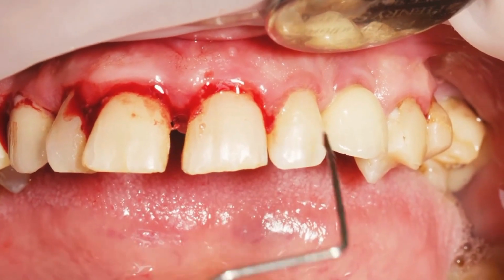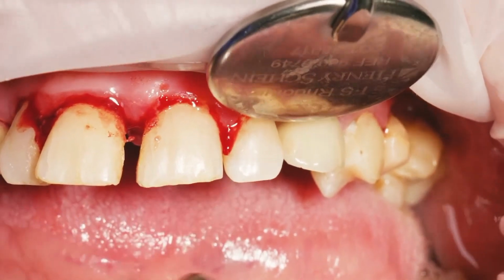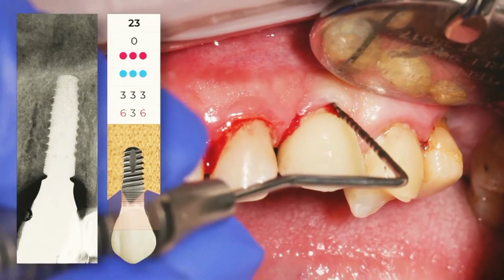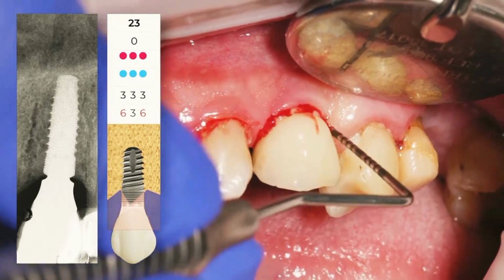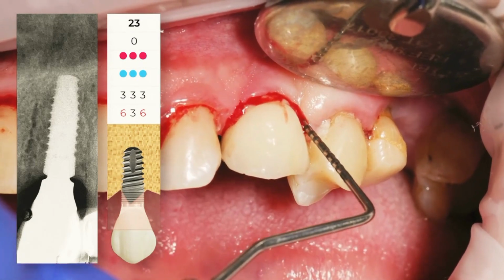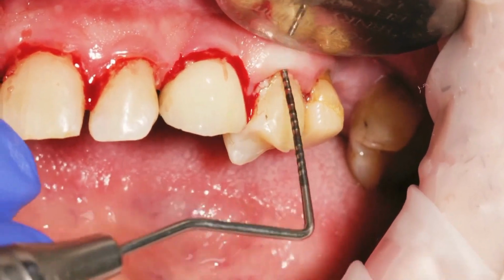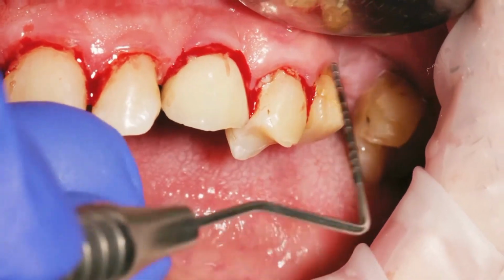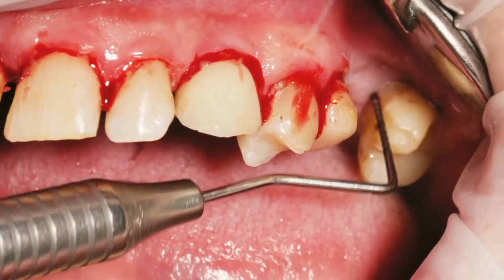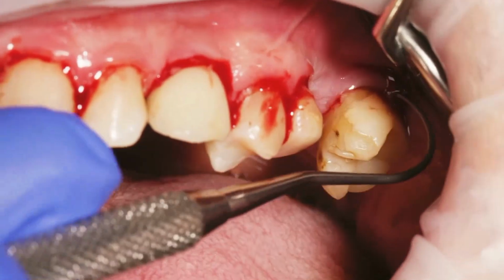And then we continue with the probing on every single side, and we test the bleeding on probing, the probing pocket depth, the recession. Another implant here, and 2.3, another mucositis site, because of bleeding on probing but no bone loss. And we also check the mobility, the furcation with the Nabers probe, and of course the suppuration, and also the condition of the soft tissues in terms of recessions and quantity of keratinized tissue.